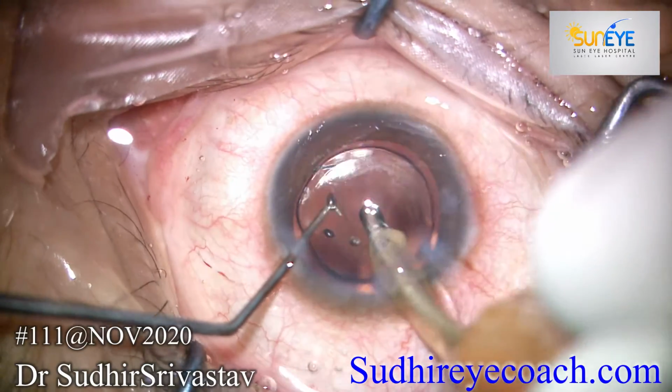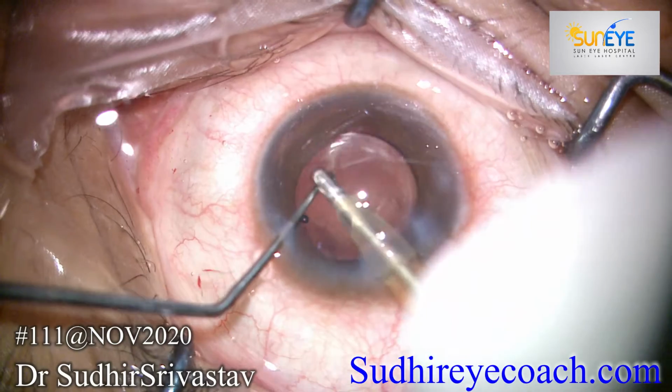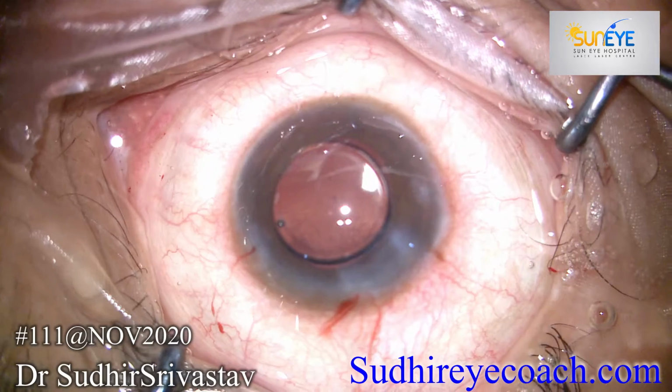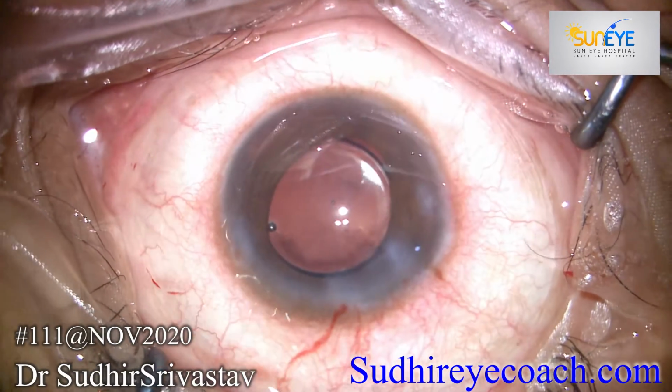So learn careful maneuvers, do good meticulous IOL power calculation, avoid the reverse pupillary block, and if it happens, control it, and learn to implant the multi-piece IOL. Definitely it will give great success to your surgery and a smile on your patient's face.